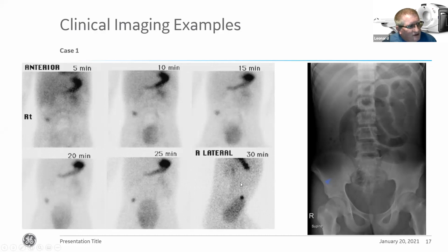And this is where I'm saying the reason we now move to SPECT is we've done a sideways picture for the last image on here, but we weren't sure from front to back where this activity was actually occurring. So it shows on here that it's lying more anteriorly on this particular patient. But again, we don't have any of the other anatomic detail that is required to fully localize that. And that's why the x-ray was needed to do comparison.